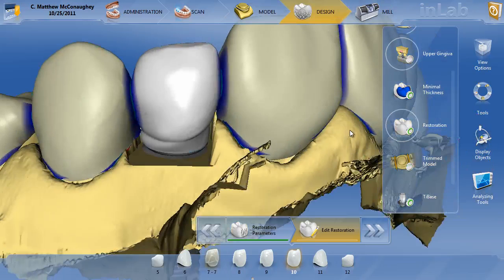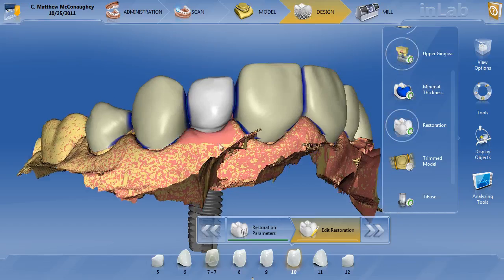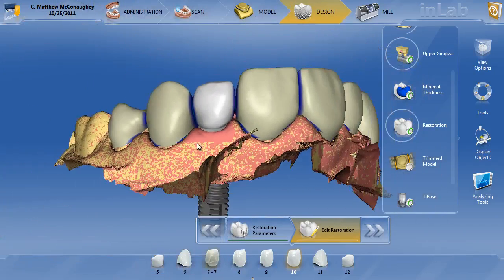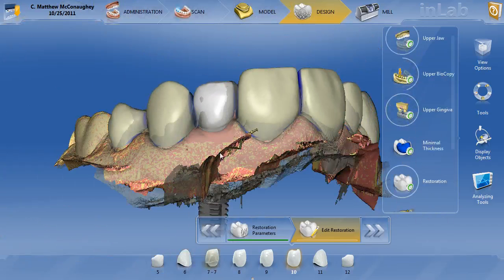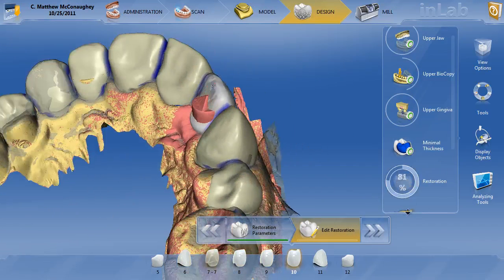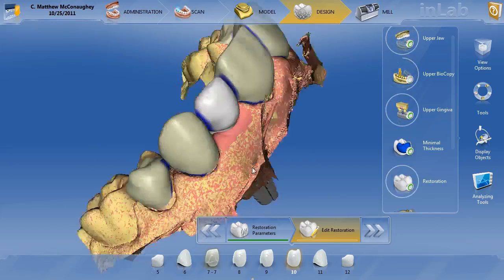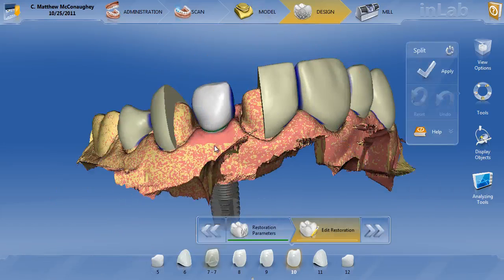Let's go ahead and take a look at the tissue — put the upper tissue on. This isn't perfectly flushed down here, but we're only working for the actual custom abutment; we don't really care about the final crown at this point. Let's go ahead and check the upper biocopy — we're pretty close to where we need to be, I overdid it just a little bit. But overall, if we put the restoration transparent, you can see we're pretty close to where that biocopy was going to be. Next step, we're going to right-click on this and split the file into the custom abutment.